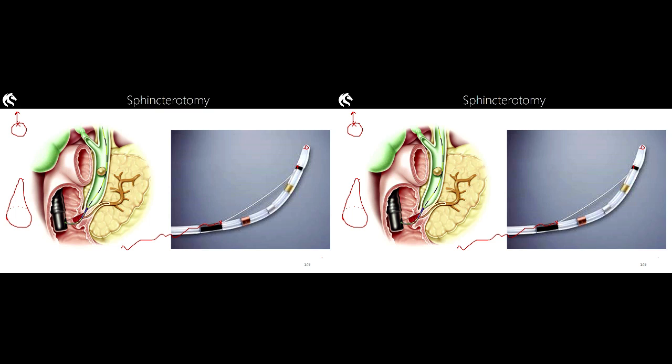Attached to that rubber pad is a wire connecting it up to the ERCP endoscopy machine. If we stick that rubber pad on the patient, we have now completed the circuit. Okay? Current can flow into the patient and out of the patient.